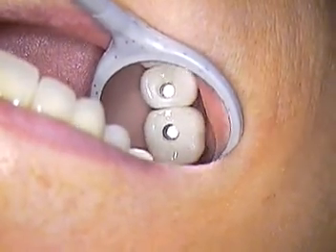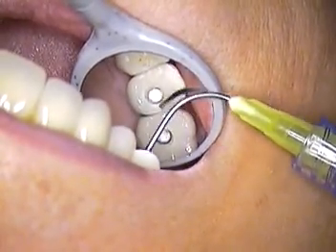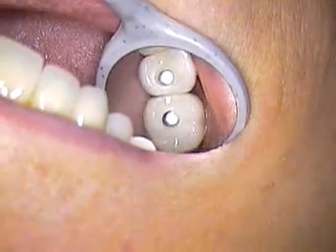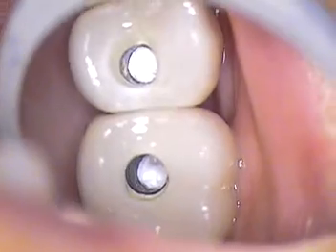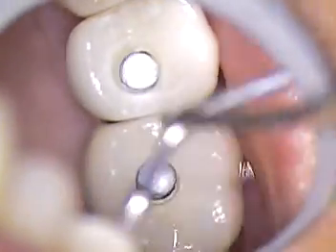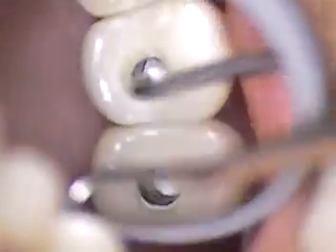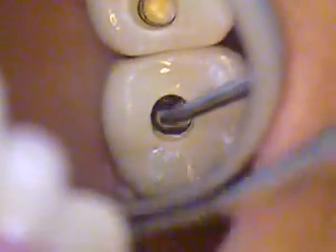I like the injectables because they come with a super small tip and they go in nice and easy. Once we finish with that, we use Cure — it is a dual-cure system, because sometimes three or four millimeters down there, you want it all cured. So it has its own dual-cure, own accelerator to a base accelerator. I've got a lower light because now we're working. This microscope from Leica Corporation has very good qualities — it allows you to work with a very dim light, and our materials do not set up.